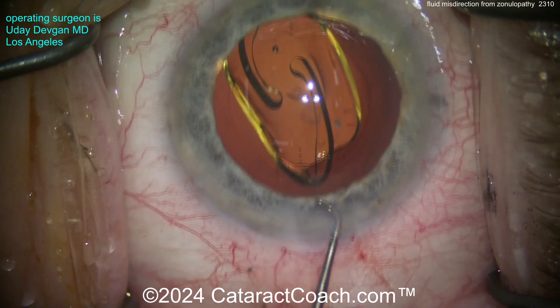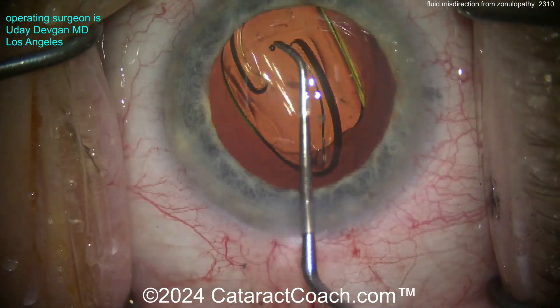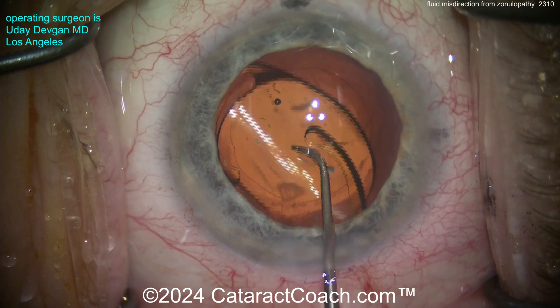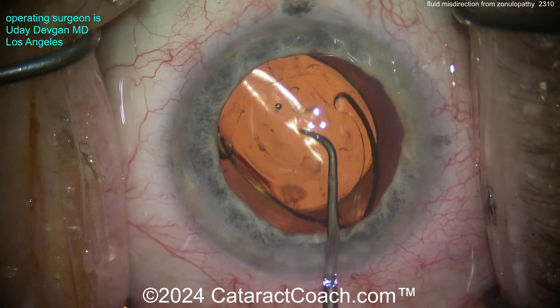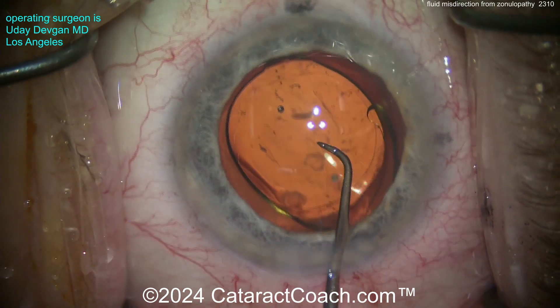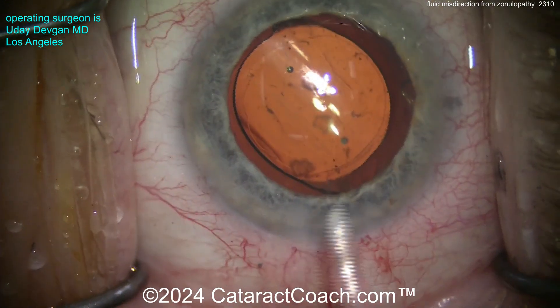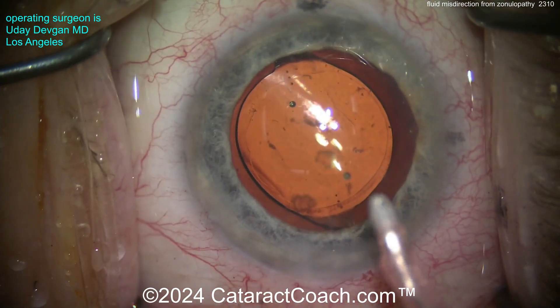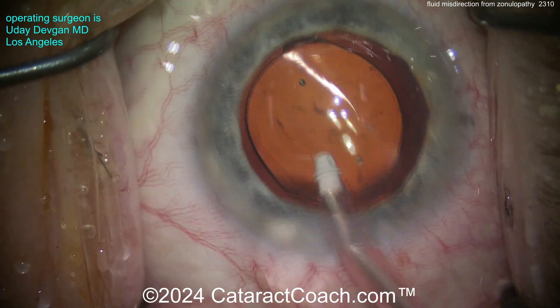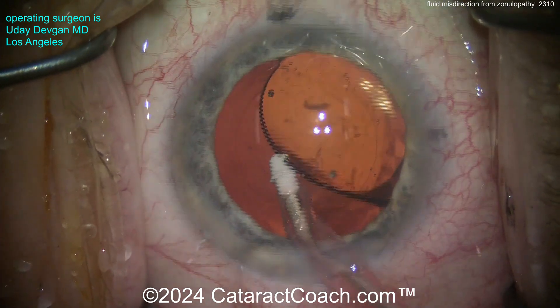The lens is in the capsular bag and now we'll get it rotated around and put it in a good position. Take a look — it's a toric lens and it's got to be lined up. Yes, of course those few little pieces of lens material are in burger space — again, behind the posterior capsule.